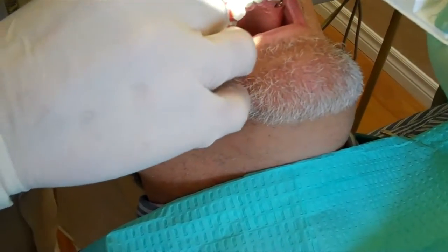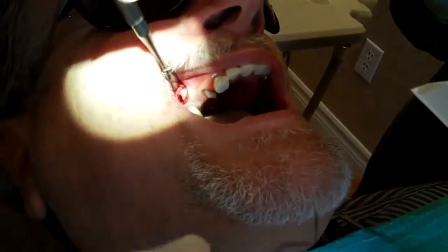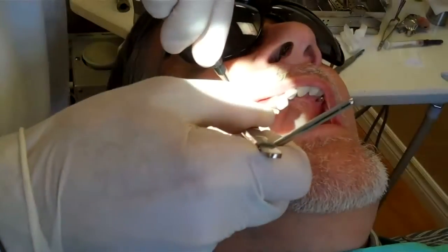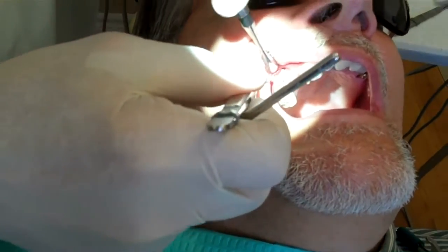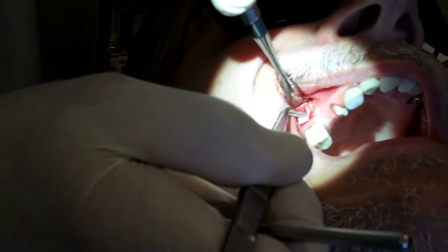But it's amazing, they found it to be very compatible with the body. We can do all kinds of repairs with it. It's got to remain a little damp, and so it will remain damp. This is a resorbable material, in other words, it will shrink down. His sinus cavity was so inflamed and infected that it literally poked right through here.